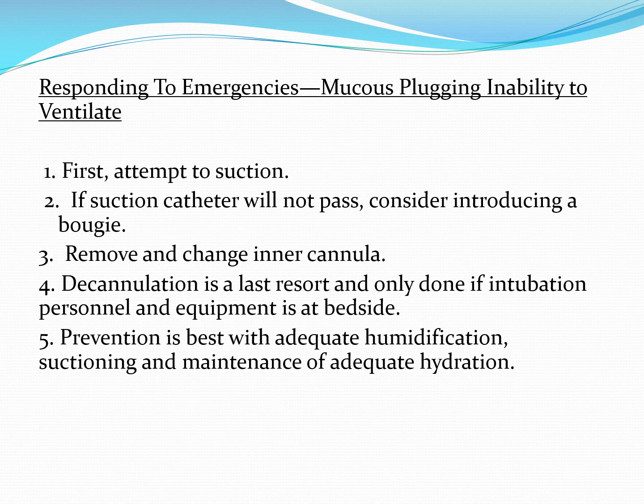Indeed, you will be taking that plug and pushing it down, but better that than not to have an established airway. Removing or changing the inner cannula is something else that should be strongly considered. Hence, there should be extra inner cannulas in the room. However, even without the inner cannula in place, you can just try to manage the patient effectively as well.